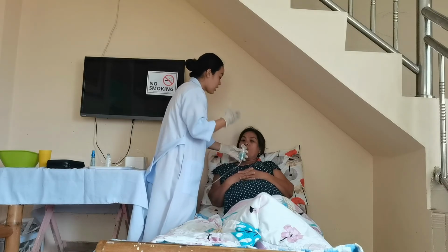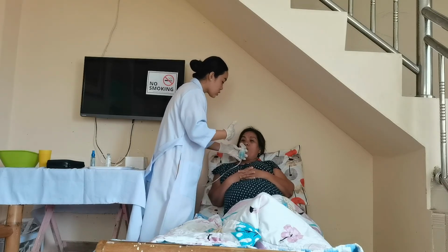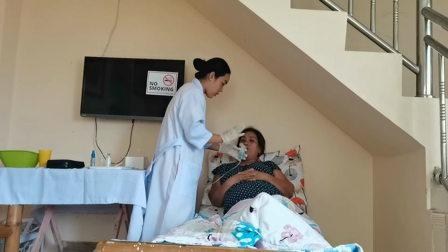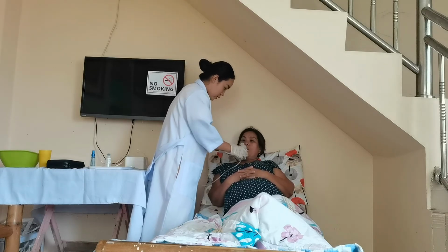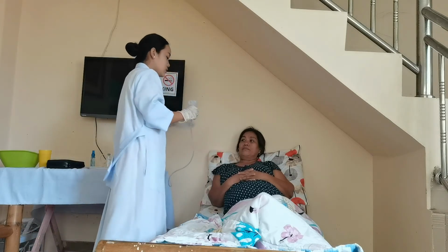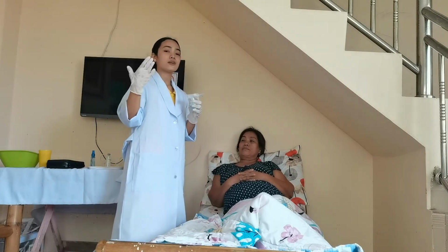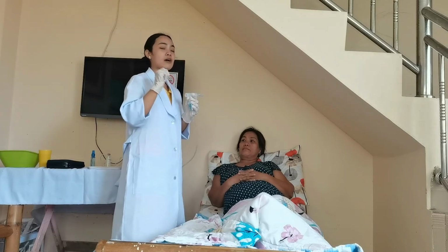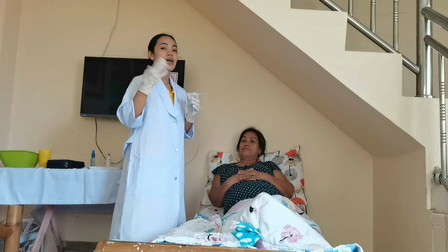Alright. So ma'am, ganito po. Inhale po kayo slowly and deeply, and then pause po tayo ng konti and exhale po. Alright po ma'am, nagaling po muna natin. So, we have to teach that to the client for her to inhale slowly and deeply and have her pause for a little and then exhale.